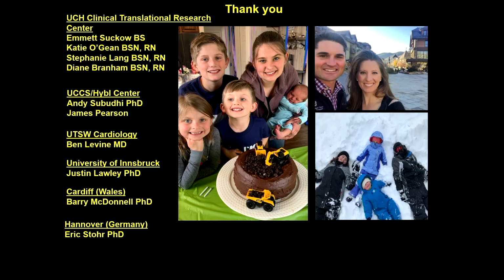The second question regarding noise, I have been surprised by these things that, we put them in people and we exercise them and we get good loops. I've been very surprised at the reliability of them once they get into place. It can take a while. I've spent a good 45 to 60 minutes sometimes getting it into a position where I like it, but once it's there, it tends to stay there and gives good data with minimal external noise.